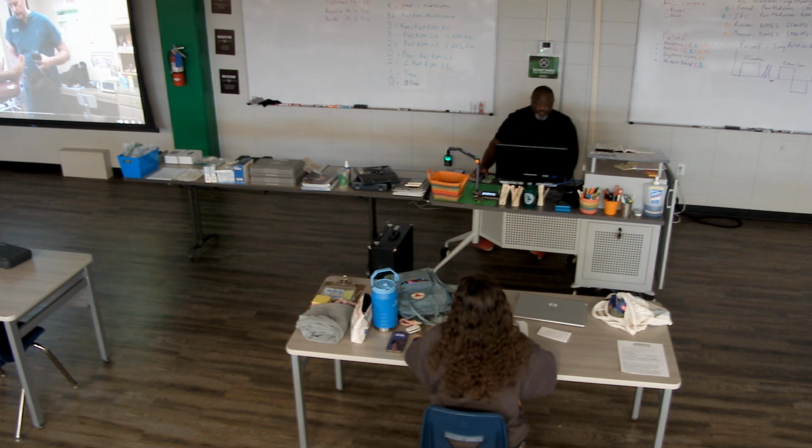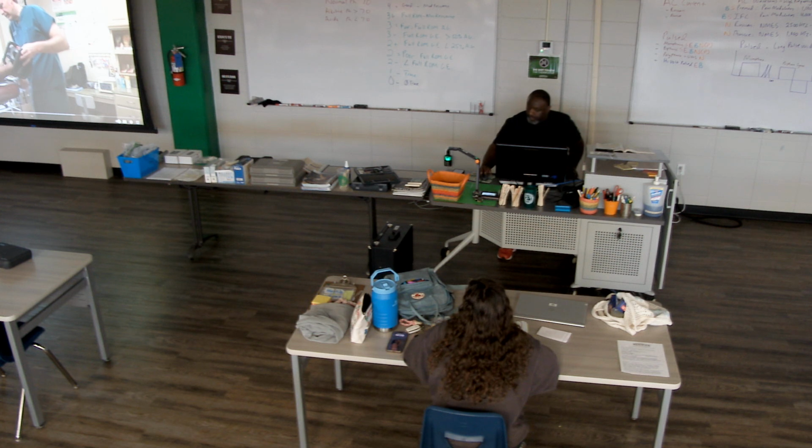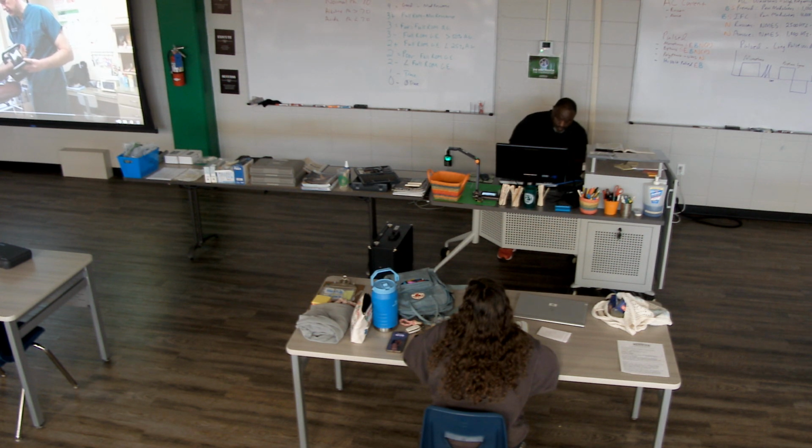What we do, we actually have this cord that's inserted to the electrical device. It has a magnet inside this area, and the current flows from one side to the other. As we know, we also have electrical current in the body, and this actually stimulates bone healing.